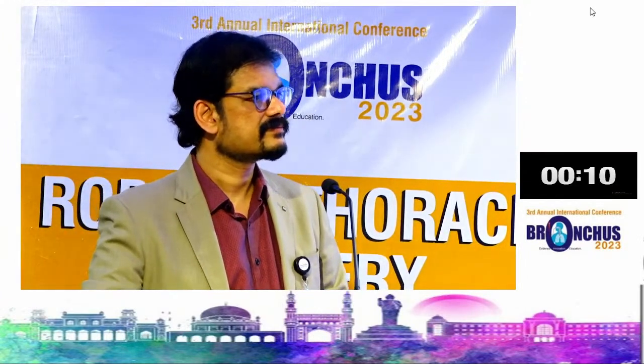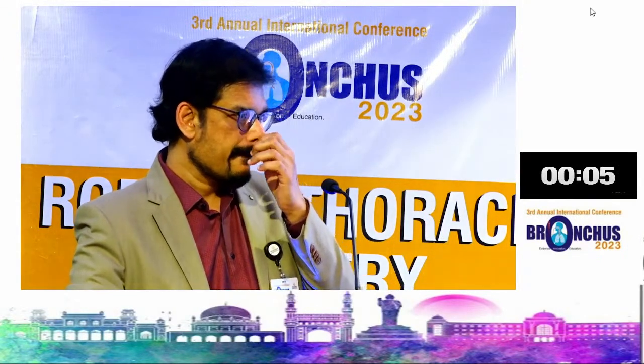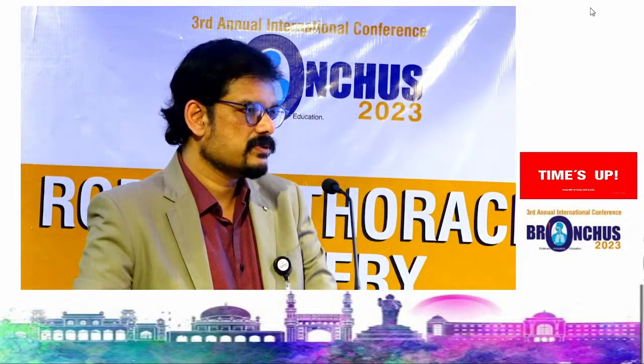I have another question. In my 20 years of thoracic surgery, I have never seen such a pristine lung. How easy or difficult are adhesions to deal with? Robotics is easy to handle adhesions unless they are really bad. In patients where you can't enter into the chest cavity, I prefer to do VATS to do an adhesiolysis and then dock the robot.